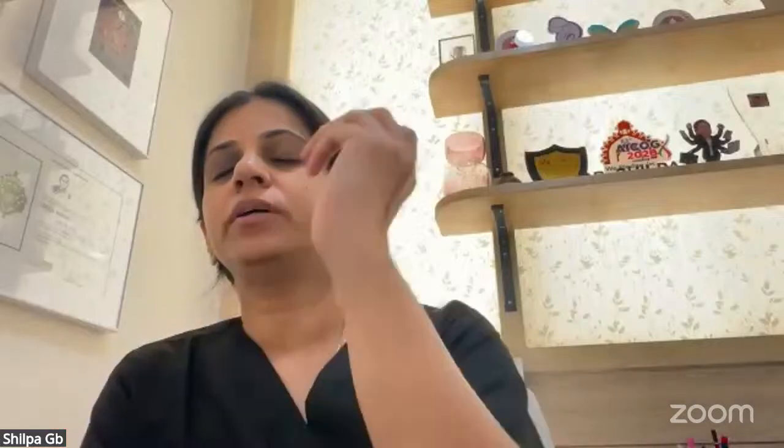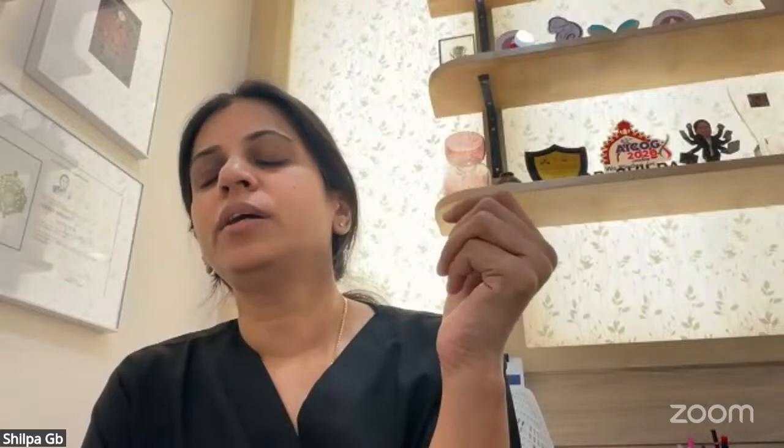The textbooks say that in open hysterectomy we have to apply the clamp perpendicular, and how to avoid the ureter. When we are doing the right uterine artery from the ipsilateral port from the left side, there is a chance of the ureter getting injured on the right side. So what are your tips to deal with it?